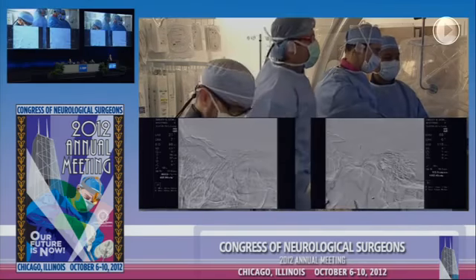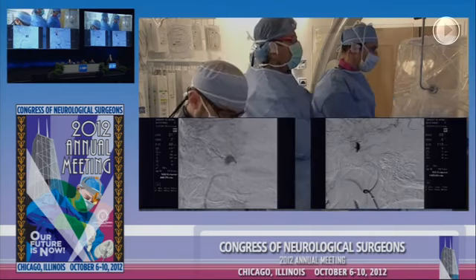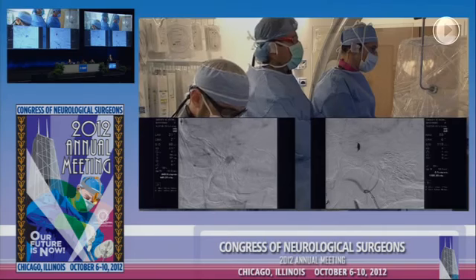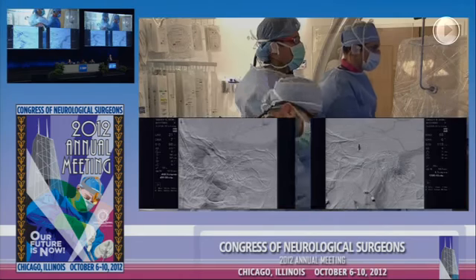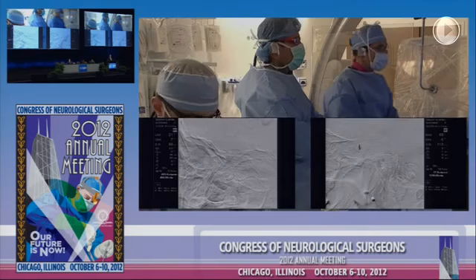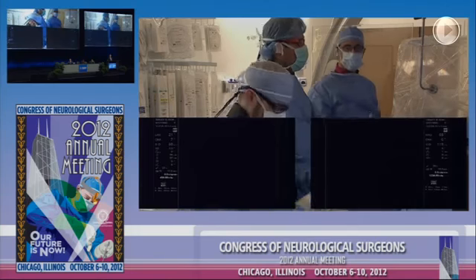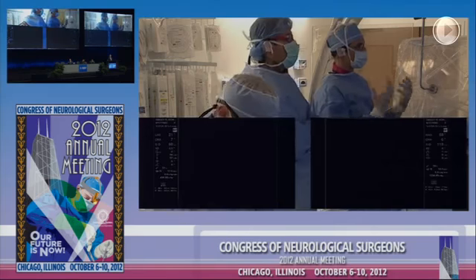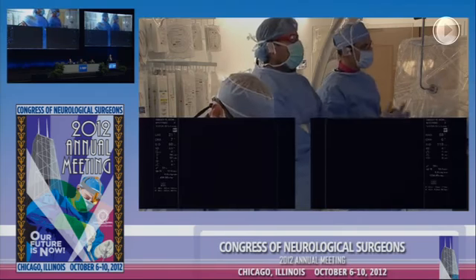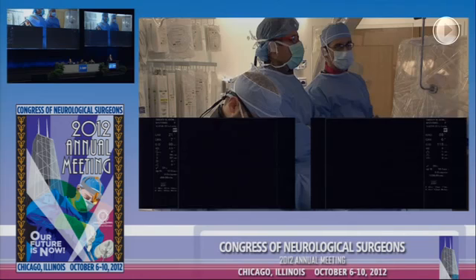I'm going to go next door. Okay, yeah, it's filling slowly, and there's a lot of stasis already. So it looks like you've deployed it in a way that really got good density over the neck of the aneurysm. You see a lot less filling in the aneurysm. Can you run that back for us, Gene? You see a delayed flow now into the aneurysm. You can see the vessels all wash out, but the aneurysm is still filled with contrast. Can you show the lateral there on the monitor, Paul?